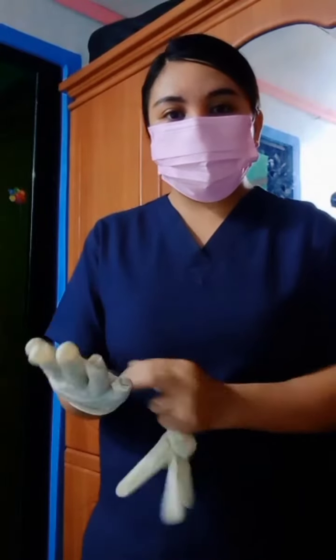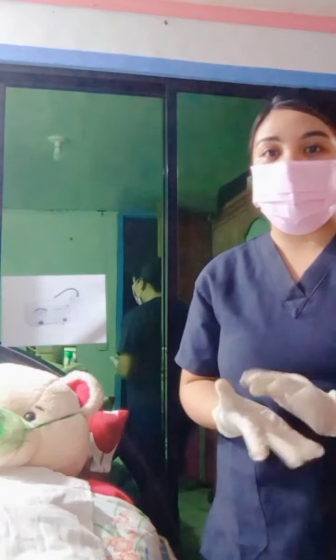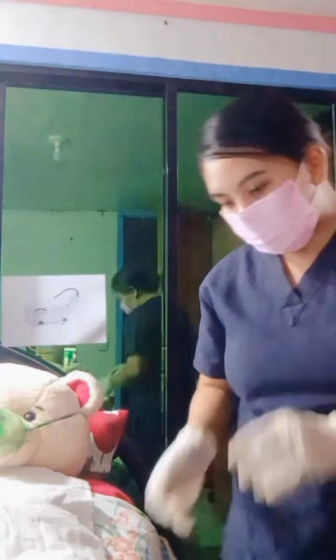After that, you need to put on the sterile gloves. Put on a mask, goggles, and face shield if splashing is likely. Prepare your equipment by connecting one end of the tubing to the suction machine. Turn the suction device on and set the pressure to the lowest level possible that will effectively clear secretions.